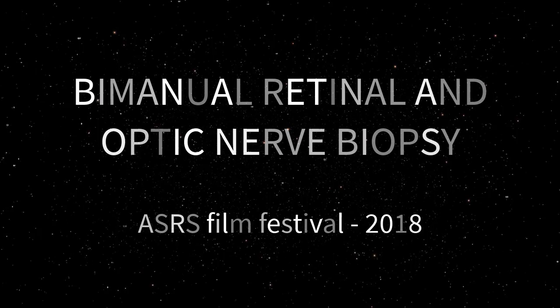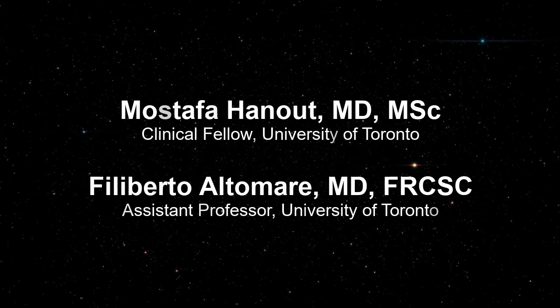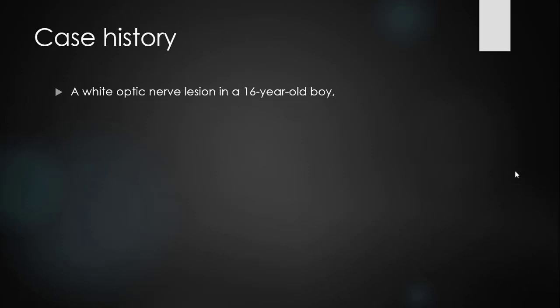In this video, we share our bimanual approach to obtain a biopsy from an optic nerve lesion with a subretinal component. The patient is a 16-year-old boy who has been monitored since the age of 8 for this whitish lesion in the optic nerve that was initially asymptomatic.